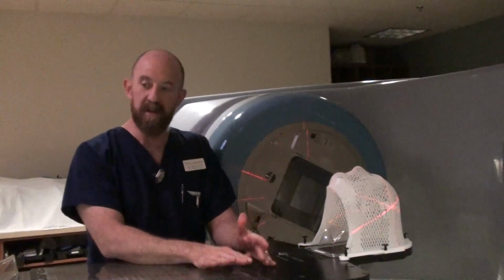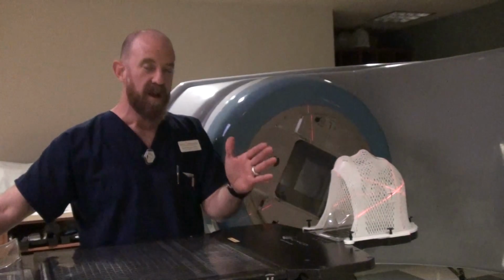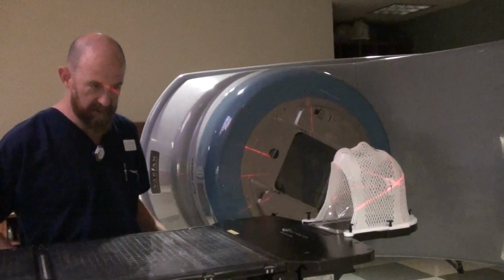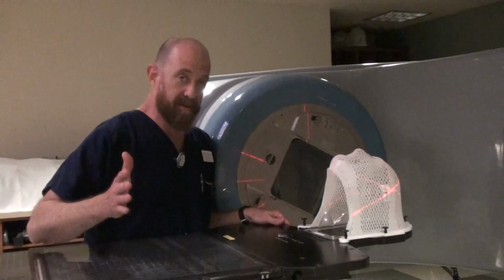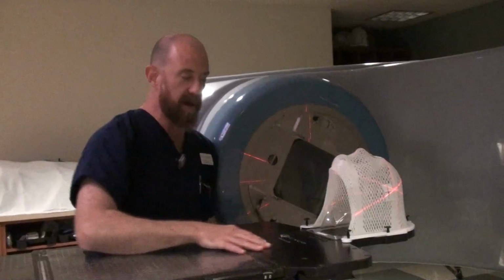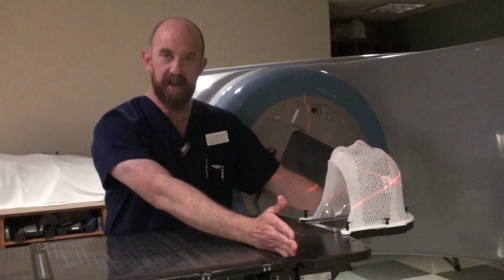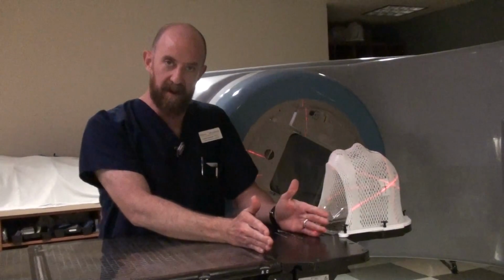Most places are going to use, say, a table pad to keep the patient comfortable. If you do use a table pad, make sure, and once again, I apologize for those of you not using Varian equipment, it's going to be a variation on the same thing. But on a Varian machine, if you have the table extender, as I have, you can see that there's kind of a delineation right here. Don't let your table pad go past there.